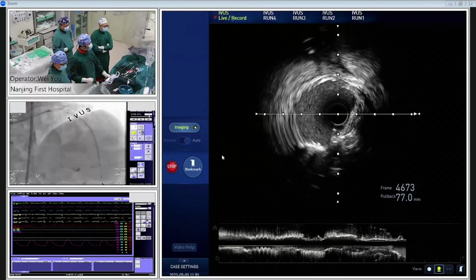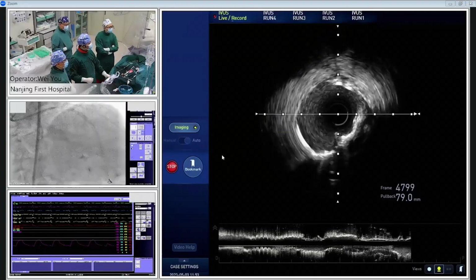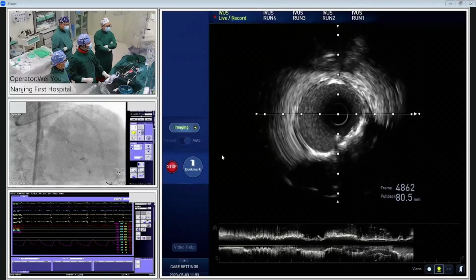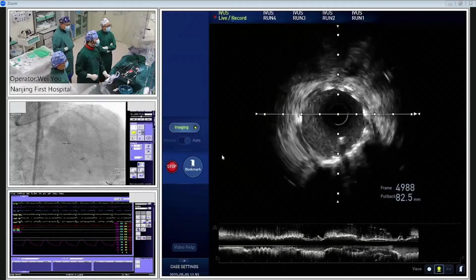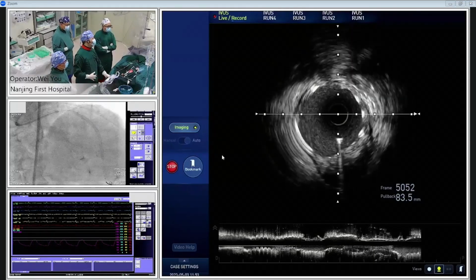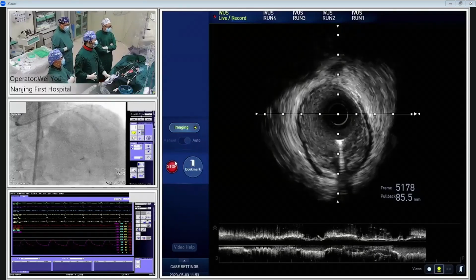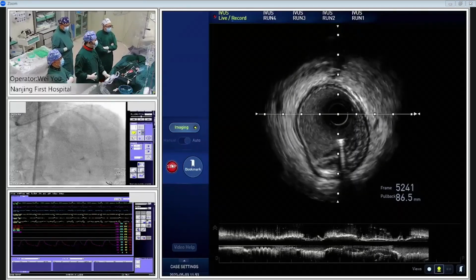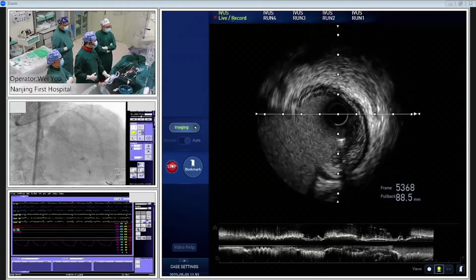Okay. You see the proximal? Yeah, the proximal looks good. Stent wall position and the expansion. Still in the stent segment. Maybe a circumflex is coming. Oh, okay. Nice, seems good. No edge dissection. I think it meets the ULTIMATE 3 criteria. Dr., please calculate.